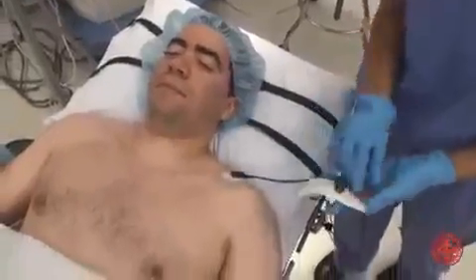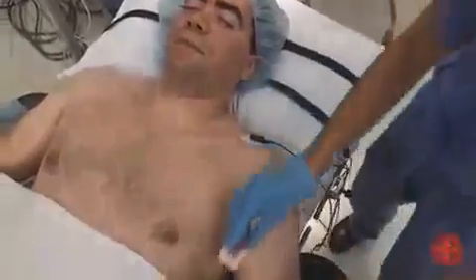Once the patient is on the operating table, the anesthesiologist begins connecting the patient to the monitoring devices. What devices are necessary for monitoring the patient throughout a general anesthetic? Anesthesiologists routinely use an electrocardiogram, a pulse oximeter, and a non-invasive automatic blood pressure cuff.